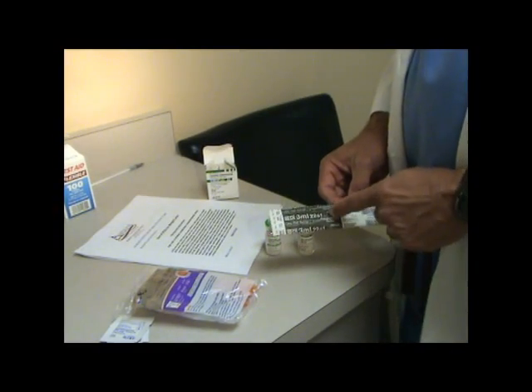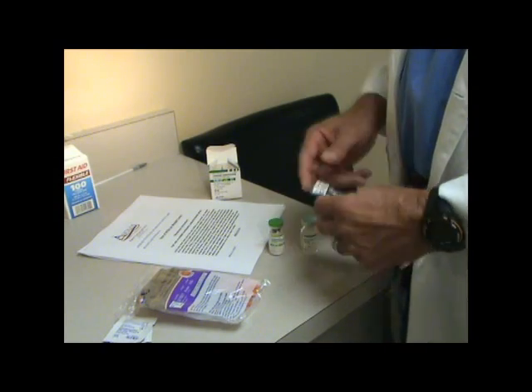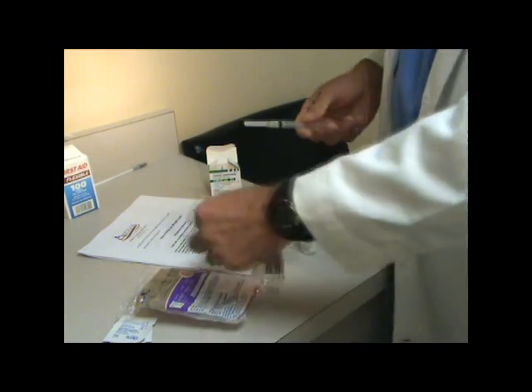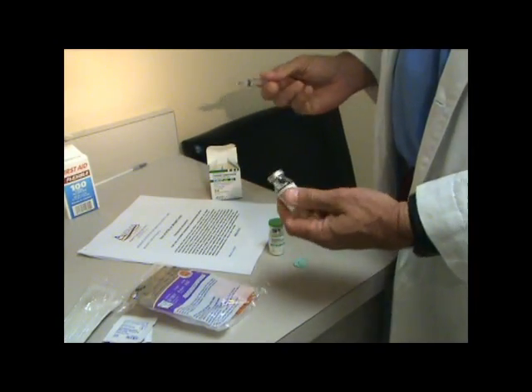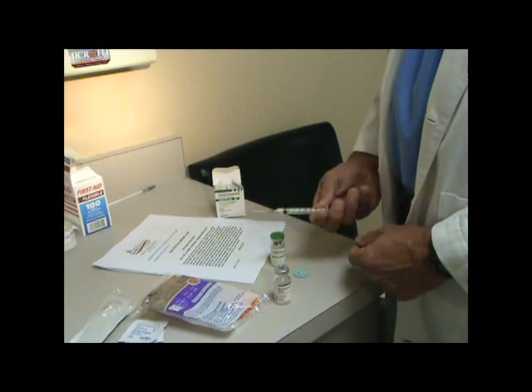I like to use the 3cc syringe, though you'll need to do it three separate times for this. Opening and peeling back, take the syringe out and pop the top off. This is sterile now. The second time through, if you need to, you can wipe it. I use this 3cc syringe.